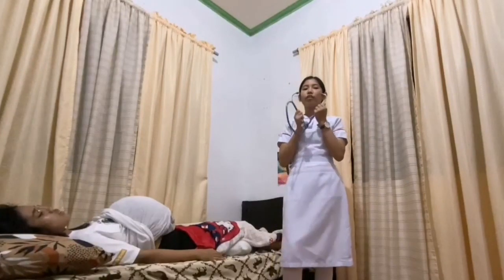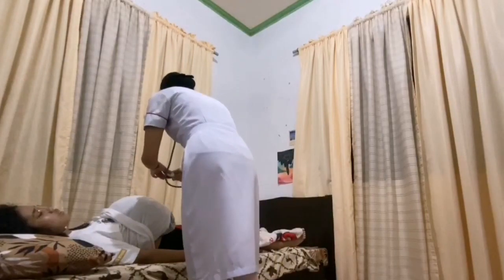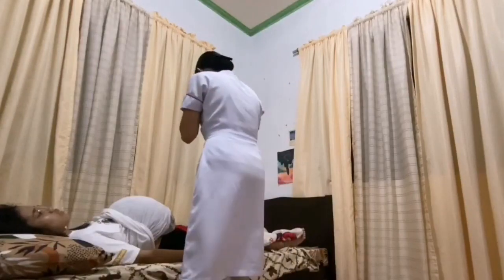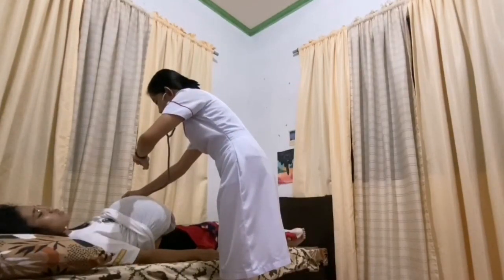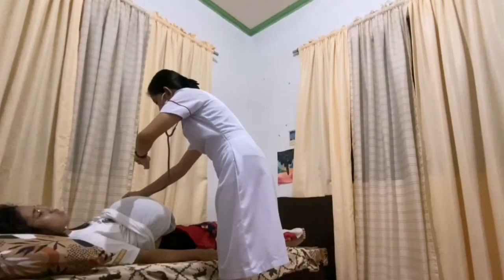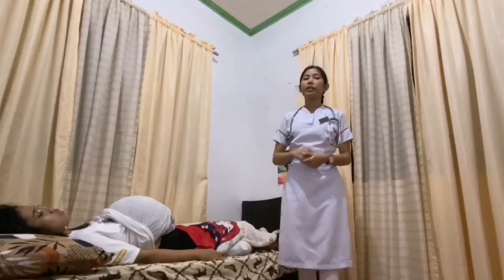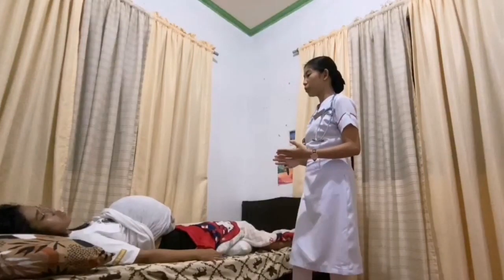The next thing is to place the earpiece of the stethoscope and listen carefully for a few minutes to provide accurate findings. In case you do not hear the baby's heartbeat, slowly move the stethoscope up or down until you pick up a sound. Moving the stethoscope to several areas on the abdomen will help locate the loudest fetal heart sounds. Count the fetal heartbeats for one full minute to accurately assess the fetal heart rate and rhythm. After one minute, the fetal heart rate is 140 beats per minute, which is within the normal range of 120 to 160 beats per minute.